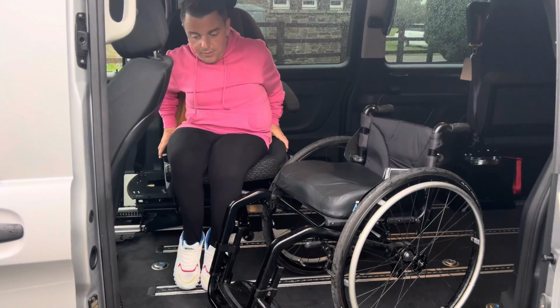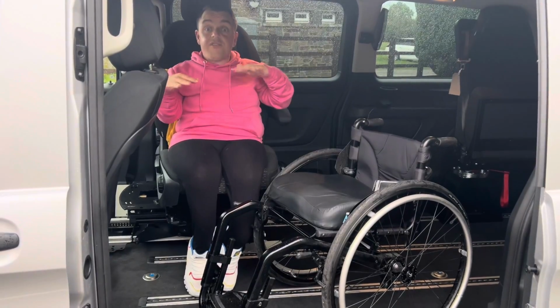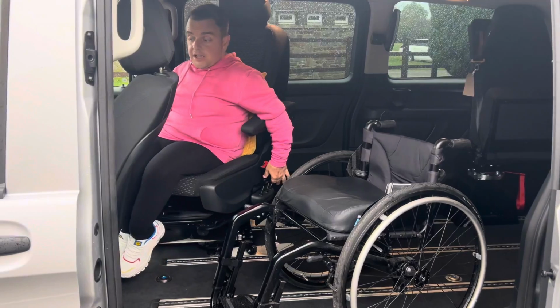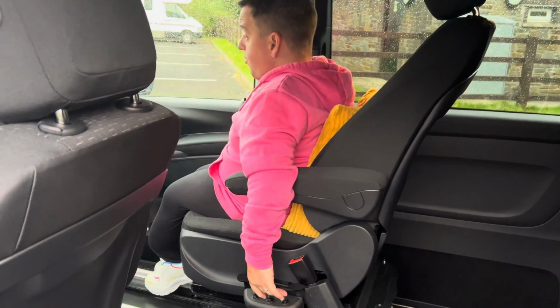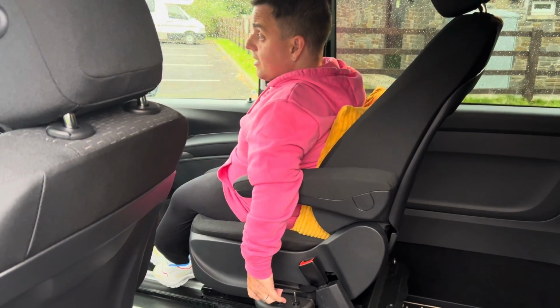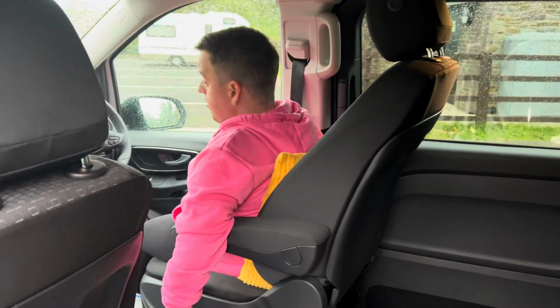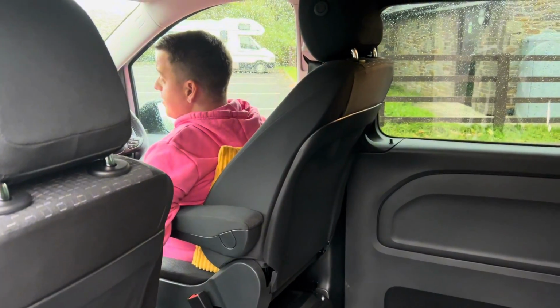So once we're in the seat, as you can see, they're not anything special. They are just normal seats, just on a different base. So on the side, there are three levers. I keep getting them confused which is which. The left one, at the right of the back, is to swivel it, and as you can see, it swivels right the way around. Then you don't have to worry about how far it's going to go around the other way because it will stop to align you with the steering wheel. The middle one is to alter the height. That one I leave quite high to transfer. And then the front one is to move your seat back into the front of the van, and then it will literally enable you to drive the van, making you completely independent.